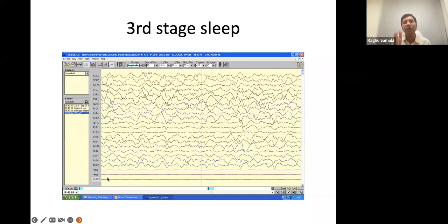So what it indicates is that once you go to sleep, the number of waves decreases. So it is as good as a coma. Till now you have seen what you see in a normal EEG. Once you connect any person to the EEG, you are expected to see the alpha waves first, predominantly in the occipital region. How do you know what is alpha? It is based on counting the number of waves and the area where it is coming the maximum. If it comes in the posterior region of the head at 9 to 11 Hz, they are called the alpha waves.